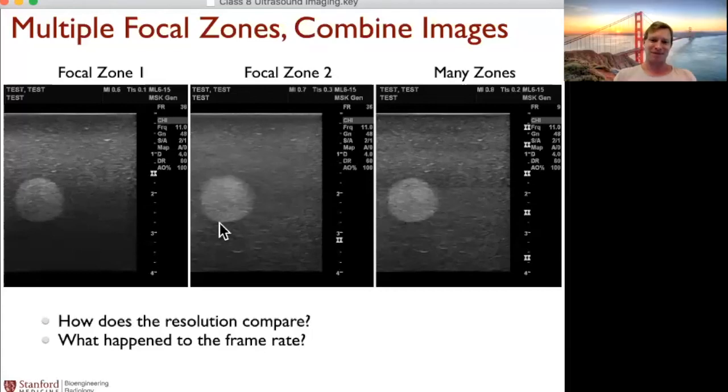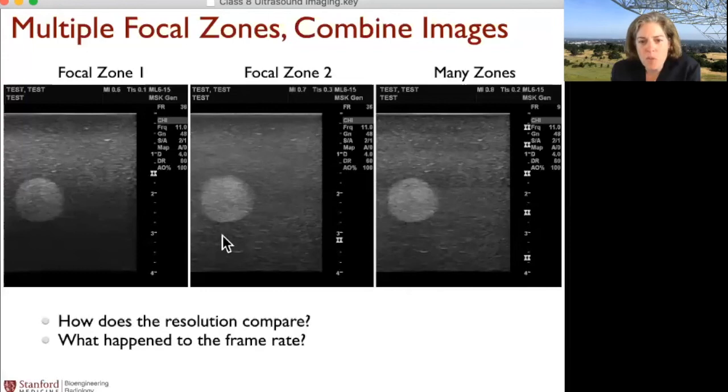Okay, all right. And so the bottom edge, which is sharper, is closer to the focal zone than the top edge. And so you might ask if the opposite is true over here, because it should be that the top edge is sharper. Well, it's certainly sharper than it was over in this image. By moving the focal depth up, we certainly have sharpened up that top edge. And then on this third one over here, it seems like both edges are sharp. So I don't know, have I convinced you now? Yeah, a little bit more.